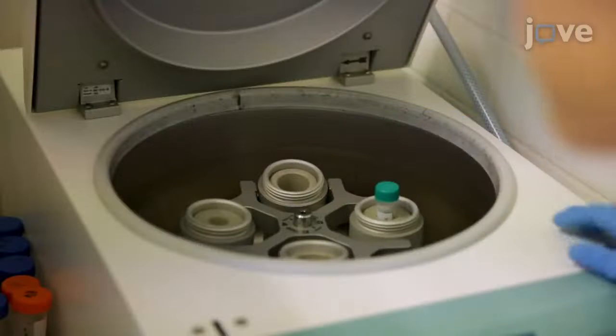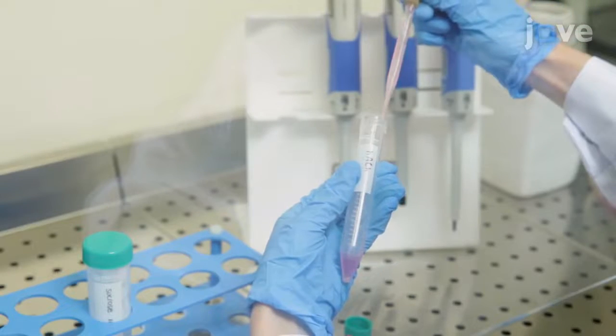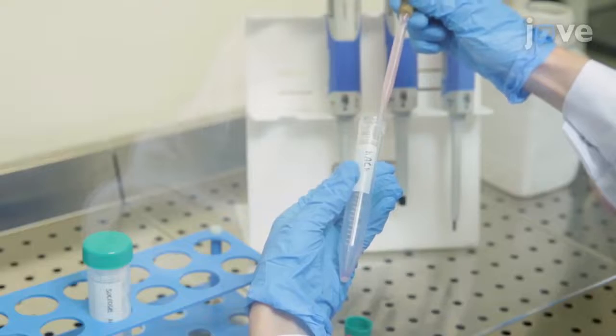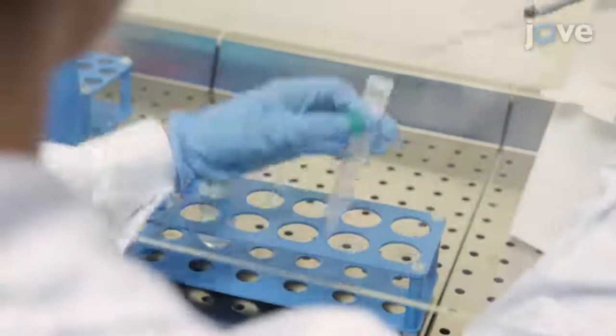Next, centrifuge the previously prepared cell suspension. Then, using a Pasteur pipette connected to a vacuum line, remove the supernatant. Add 2 milliliters of 10% sucrose to the cell pellet.